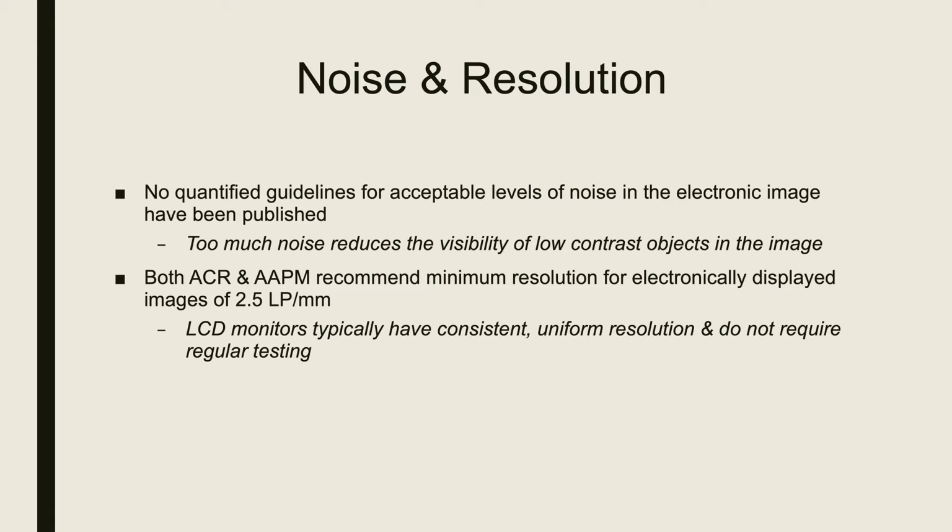Both the American College of Radiology and the physicists recommend a minimum resolution for electronically displayed images of 2.5 line pairs per millimeter. So that's pretty detailed resolution. And LCD monitors typically have very consistent and very uniform resolution, so they don't even require regular testing, which is why they're so fantastic in radiology.